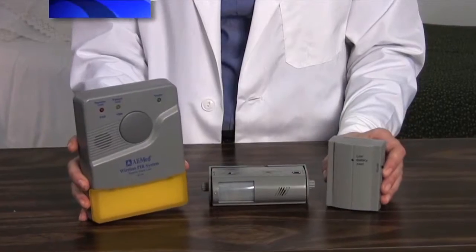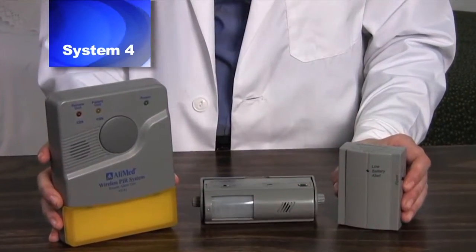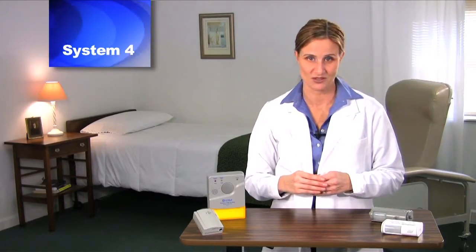System 4 combines Systems 2 and 3, giving the option to sound in three locations. It includes the alarm unit, remote receiver, and nurse call receiver. For more detailed instruction on System 4, please see video 4.